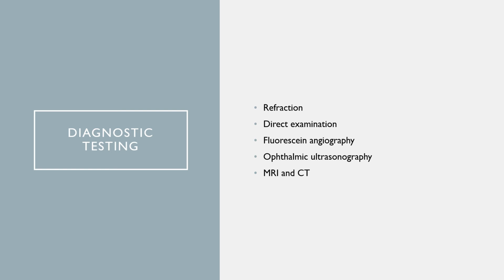Fluorescein angiography is where we are going to inject fluorescein dye intravenously. When that dye reaches the retina and choroid, the vessels and epithelium are clearly delineated, and those images can then be recorded.